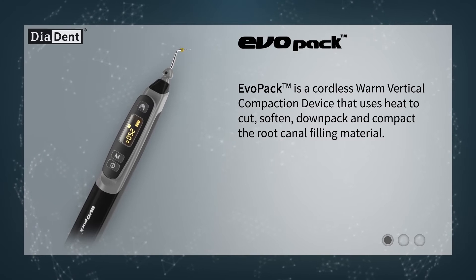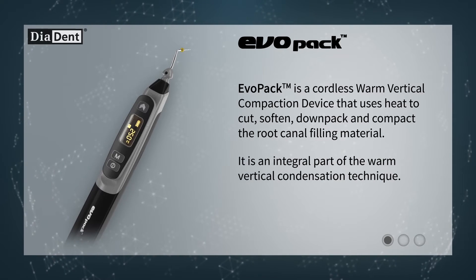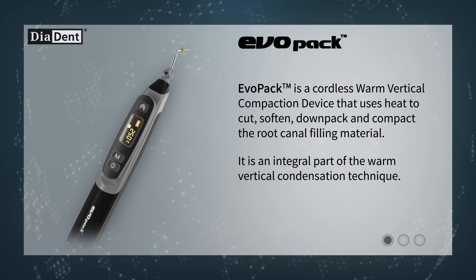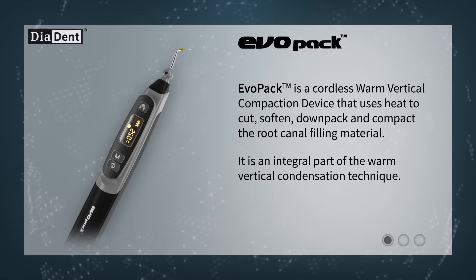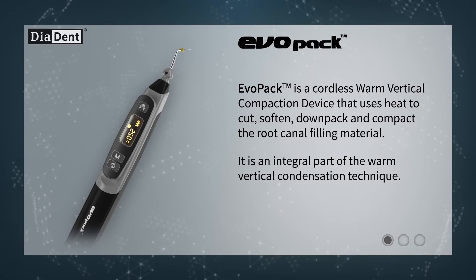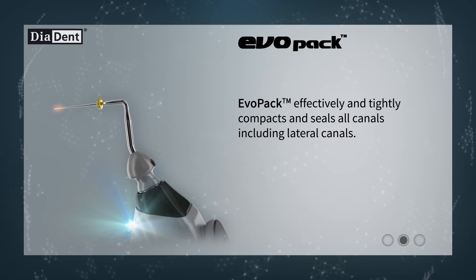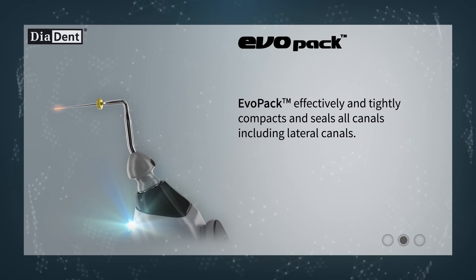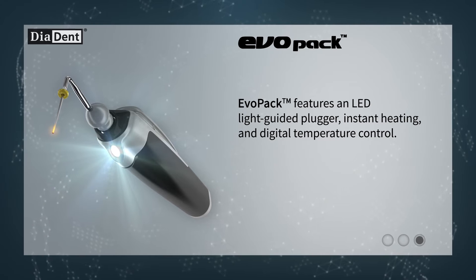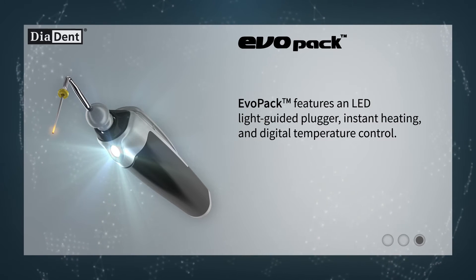Evopack is a cordless warm vertical compaction device that uses heat to cut, soften, down pack, and compact the root canal filling material. It is an integral part of the warm vertical condensation technique. Evopack effectively and tightly compacts and seals all canals, including lateral canals. Evopack features an LED light-guided plugger, instant heating, and digital temperature control.